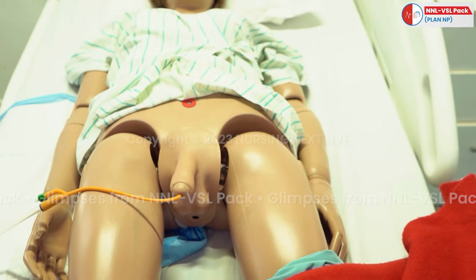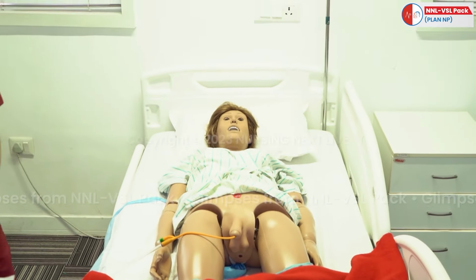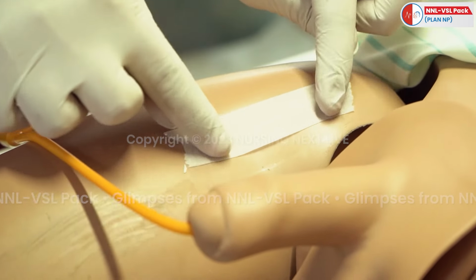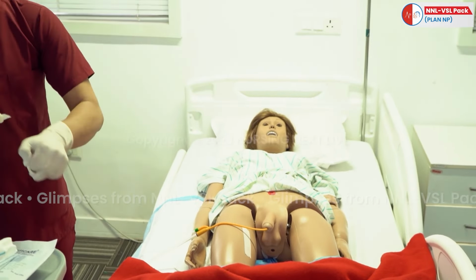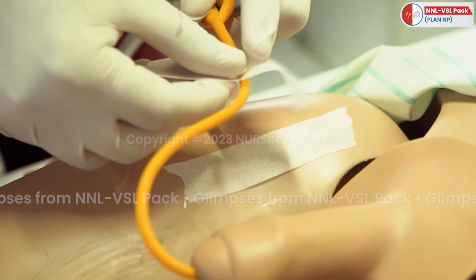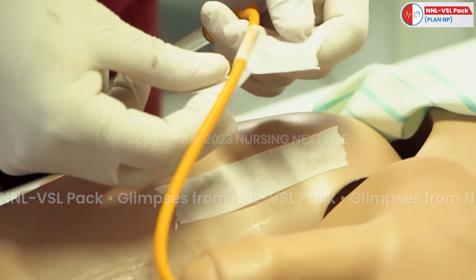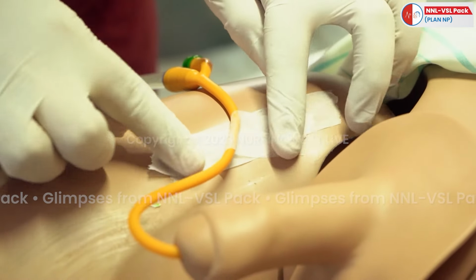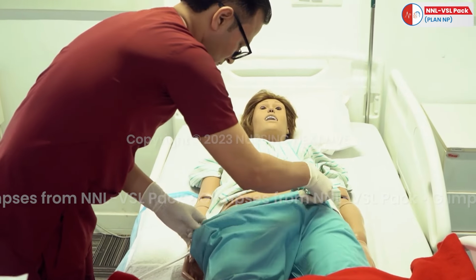Secure one end of the catheter with the help of micropore. Remove the old underpad sheet and spread the new one.